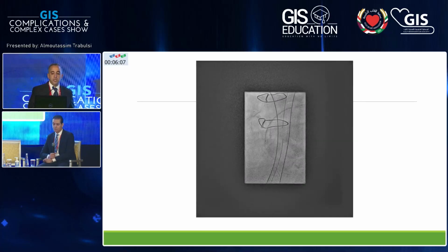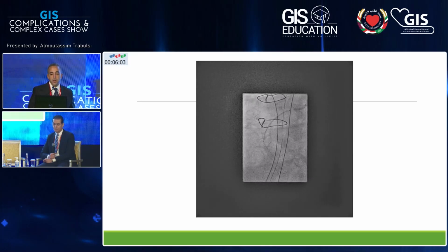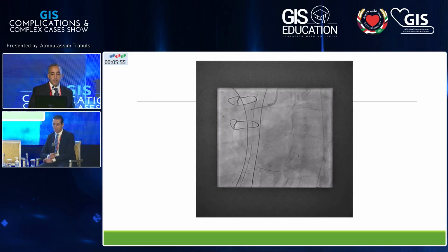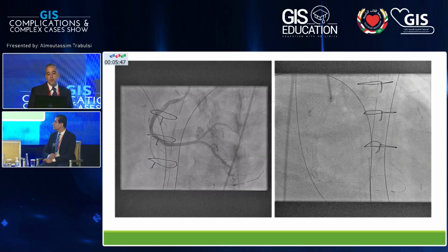I took a second stent as well, that was another 4.0 by 38 Resolute. And then I had to cover all the way back to the ostium with a third short stent. It was a 4.0 by 18 Resolute. Then I took a 4.0 NC and post-dilated the stents. And here are my final pictures.